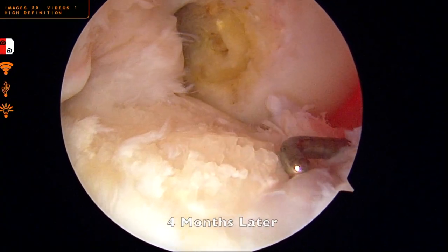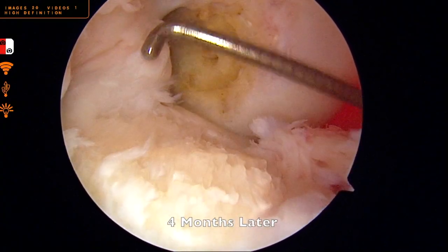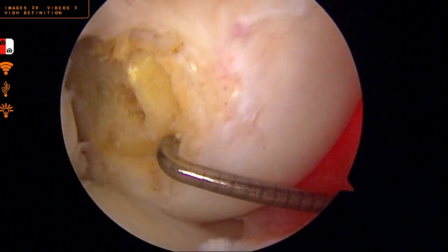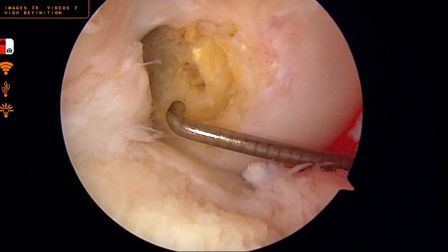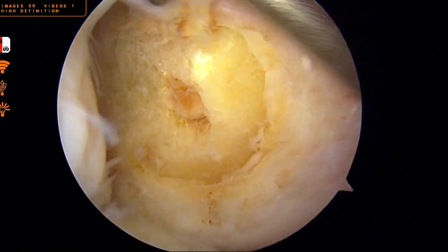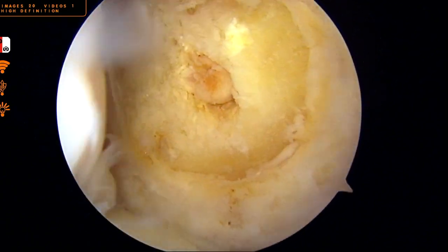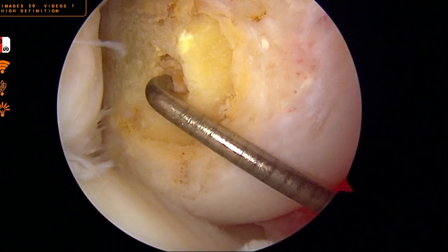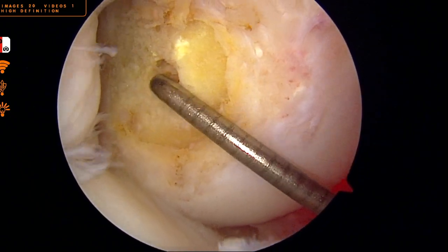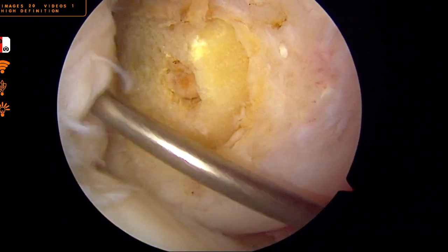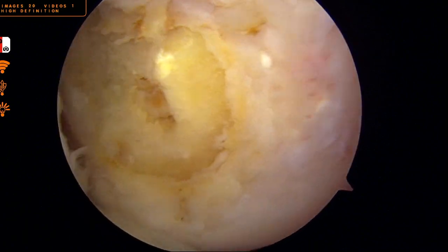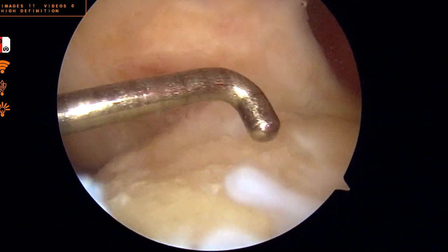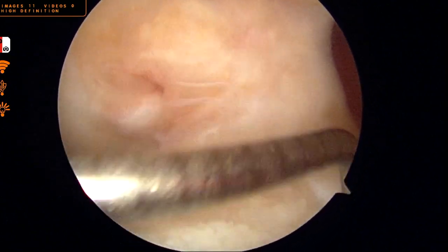Here we are four months later, after x-rays and a CT scan demonstrated appropriate incorporation of the bone grafts. We can see the previously placed femoral bone dowel within the tunnel, which has incorporated nicely into the patient's native bone and remains very stable. Similarly, the tibial bone graft is also incorporated nicely.